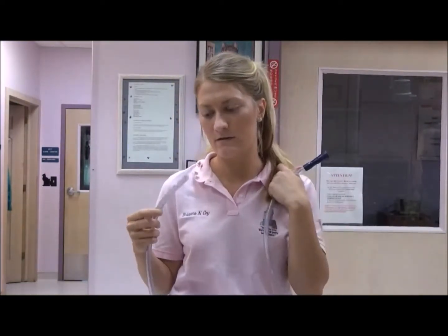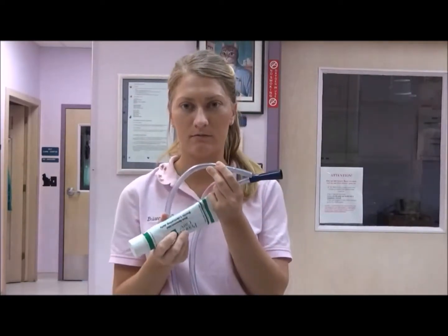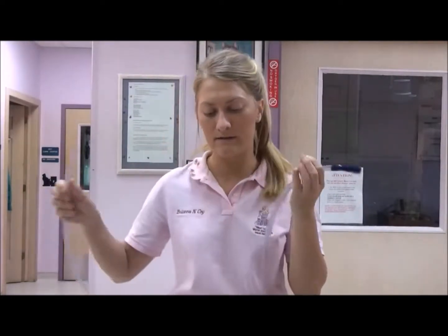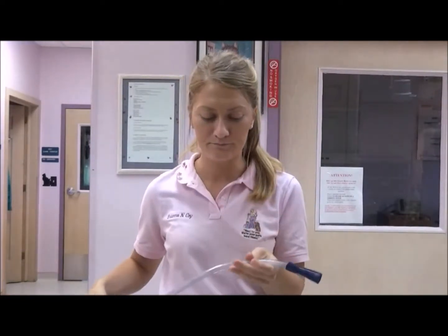And the first thing that you always want to do when you place the tubing is you want to moisten it with water or some lube, but it's key that you make sure you have it cut or measured to the appropriate size. And it's often necessary for a patient who's experiencing bloat.